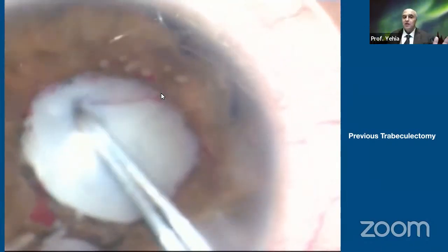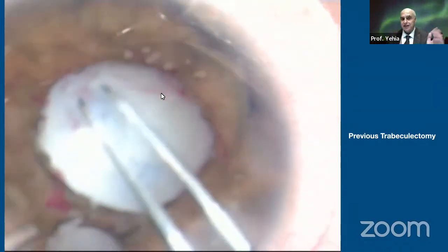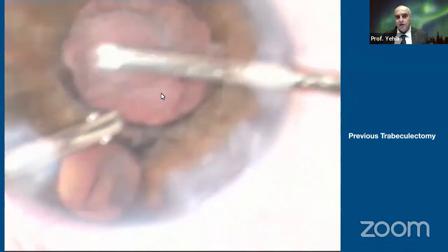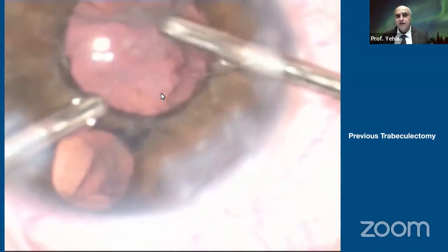So now you are facing the first challenge, doing the capsulorhexis in a shallow chamber, with synechia, and you're missing the cataract view. So we got over all this, and it's a white cataract, so it's not really hard. So you don't need to use ultrasound. You just aspirate the content. So this is the part, the difficult part is finished.